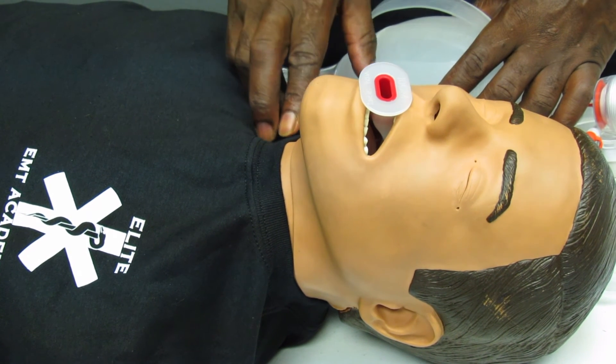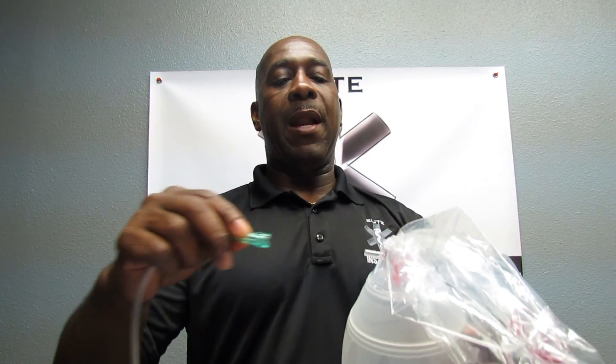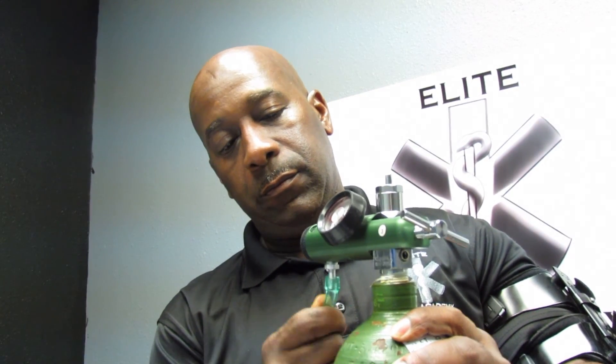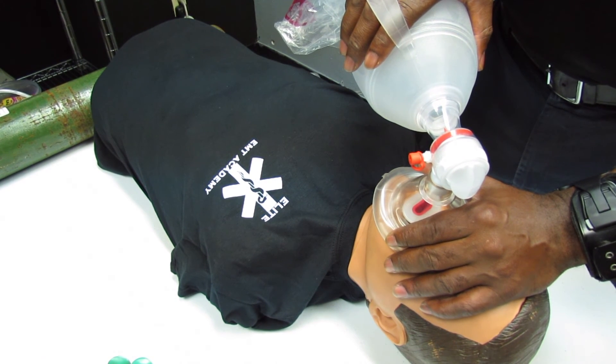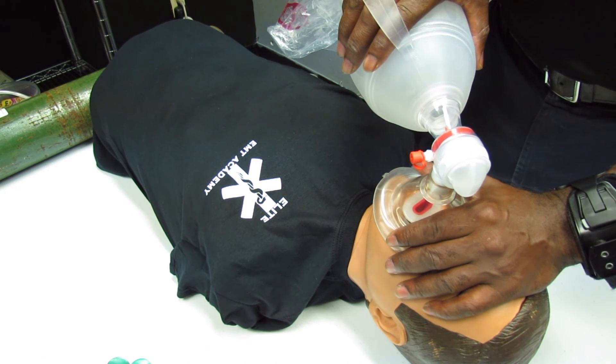Recheck for a pulse for at least five seconds but no more than ten seconds. Attach the oxygen tubing to the stem at the bottom of the BVM, then attach the oxygen tubing to the regulator. Adjust the flow to 15 liters per minute. Once oxygen is connected and flowing at least 15 liters per minute, ventilate your patient with one breath every five to six seconds, or ten to twelve breaths per minute.